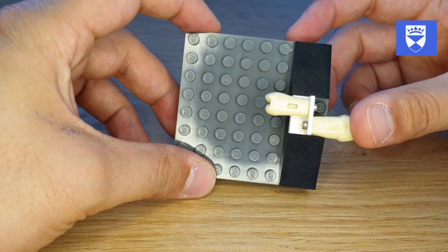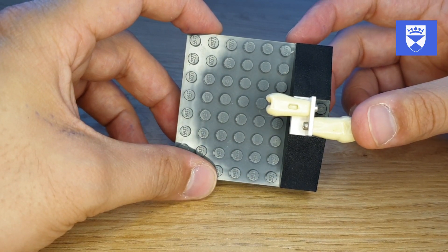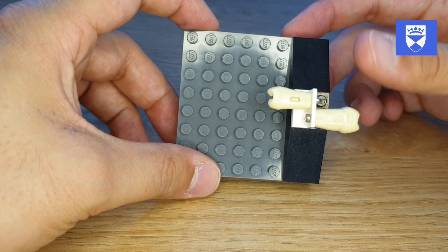You can see here a simple rectangle that's been cut on the root surface that otherwise would have been wasted.